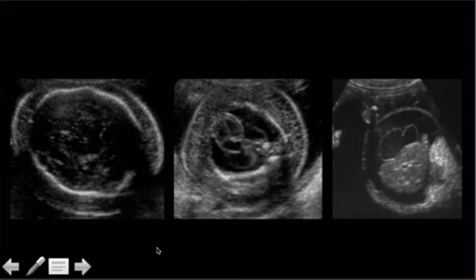All right, and then twins get twin transfusion stuff, especially if you're sharing a chorion, and they end up with terrible things that can happen to them, like this. What I'm showing you here is really thick skin, abdominal wall edema. We're at the level of the heart here, so the lungs are floating, with big pleural effusions, and down in the abdomen, a big bunch of ascites. So all this is bad. Fetal hydrops is a bad thing.